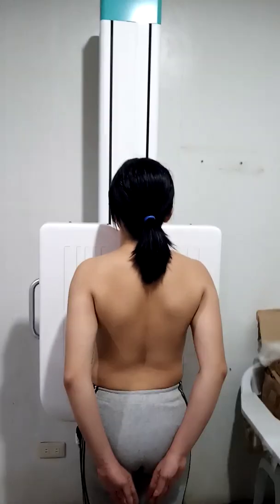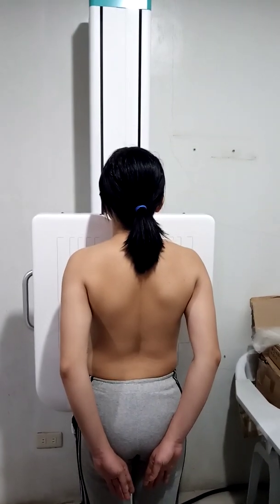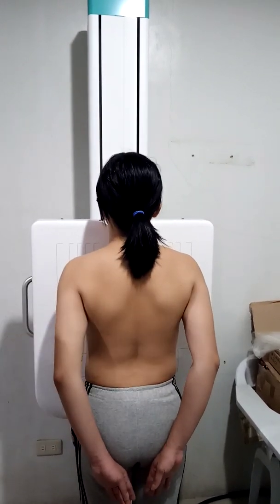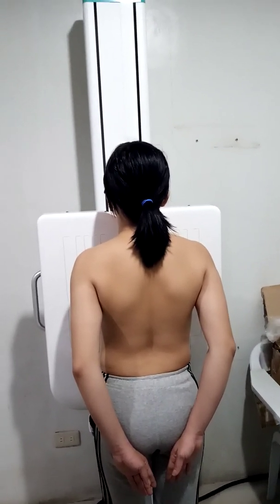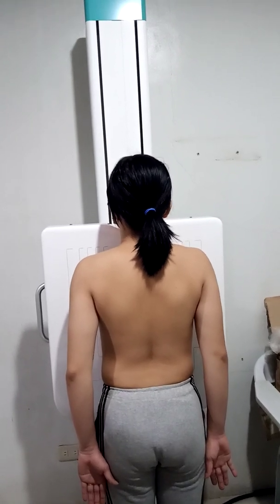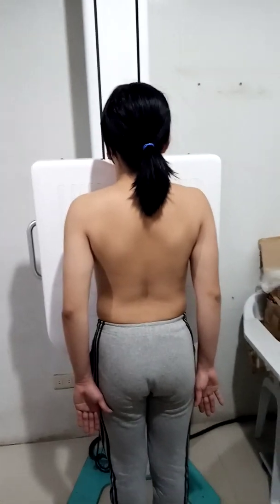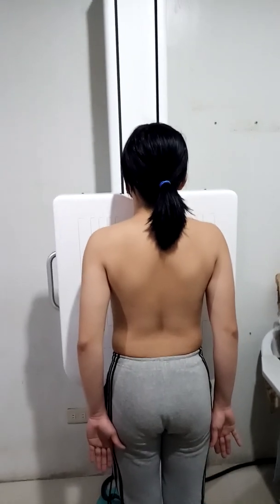Then, next is place the top of the IR, or image receptor, approximately 1.5 inches or 3.8 centimeters above the shoulders. The next is have the patient roll shoulders forward and rest the back of the hands on the hips. So back of the hands, forward. Next, always remember that we need to shield the gonads of the patient because these are one of the most sensitive parts of the patient's organs.